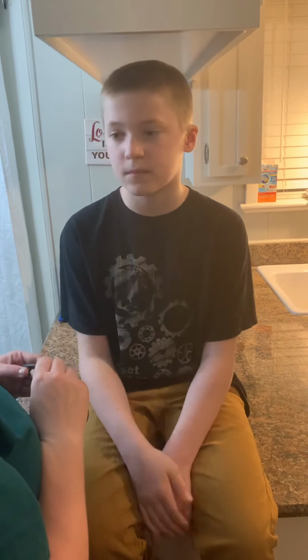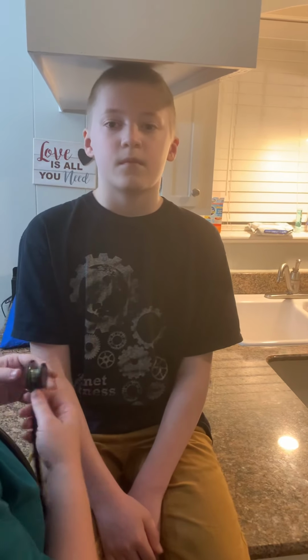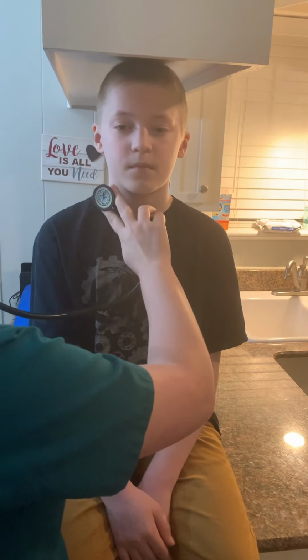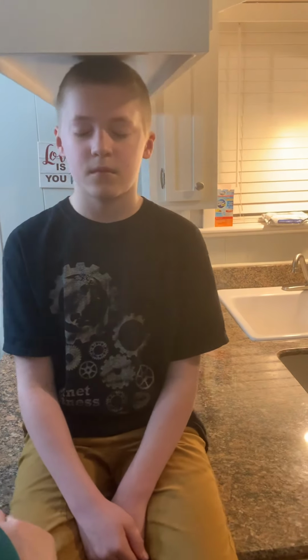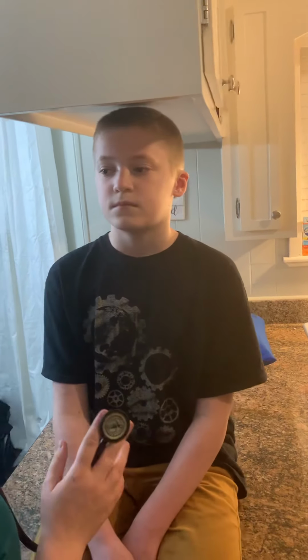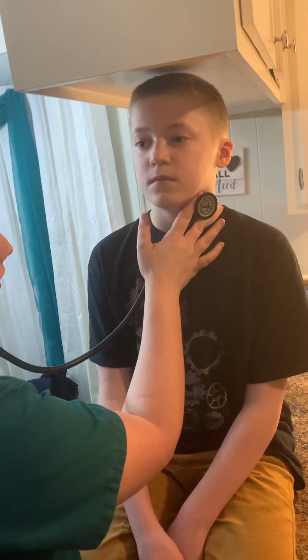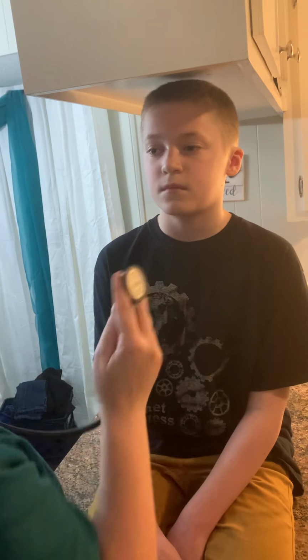So the next thing we're going to do is I'm going to turn over to the bell of my stethoscope, which is the smaller side. And I'm going to listen to your carotid arteries. So what I want you to do is take a deep breath in, blow it out, and then you're going to hold it. Okay, and you can breathe. And I want you to do the same thing again, and we're going to listen to the other side. Deep breath in, hold it. Okay, and now you can breathe.